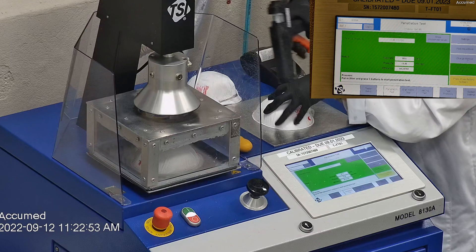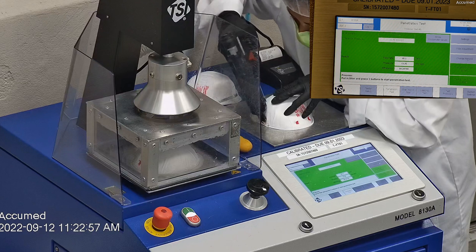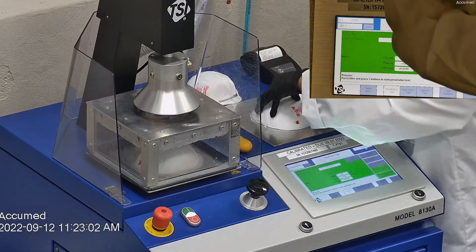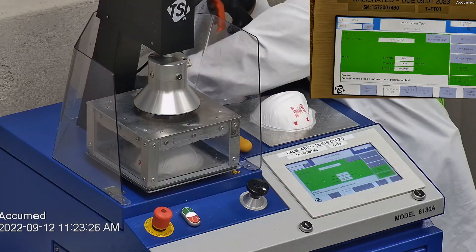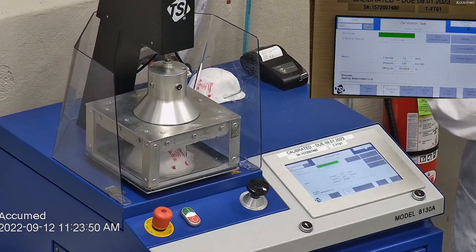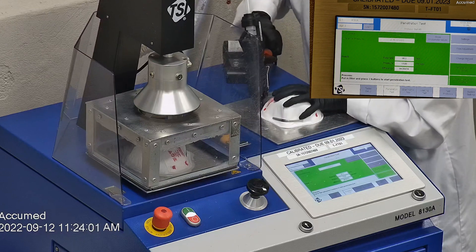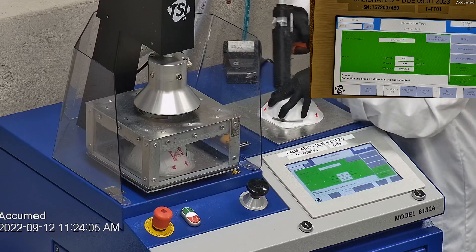The first sample's filtration percentage was 97.71 and a pressure drop of 12.6 millimeters of water. The second sample had a filtration percentage of 99.06 and a pressure drop of 13.9 millimeters of water.